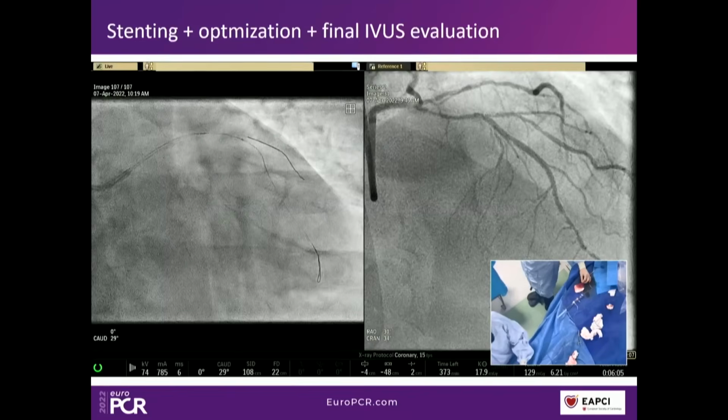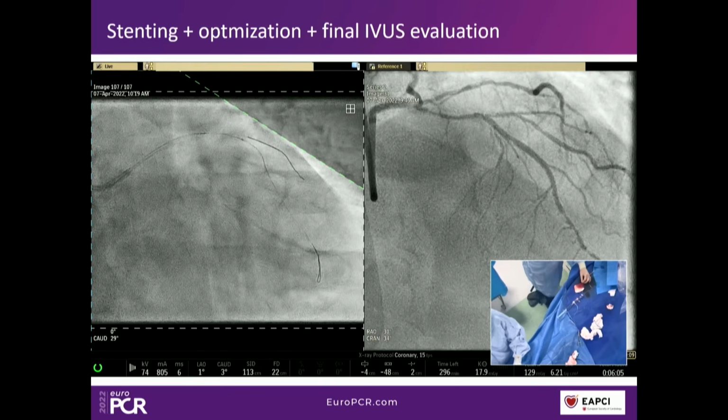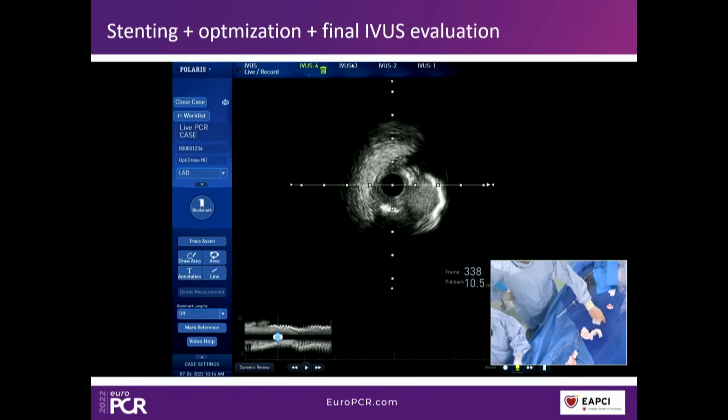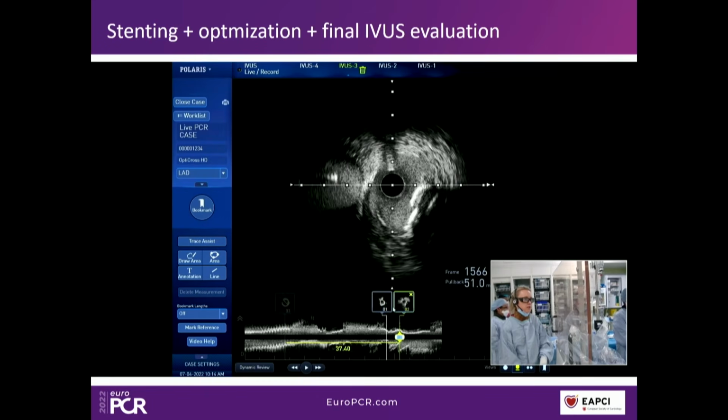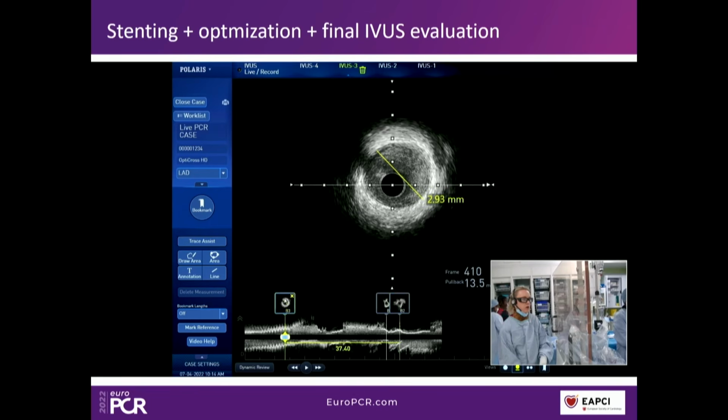Yes, and what about stent sizing, Claudia? What did you think about stent sizing and stent selection? The length from there to the ostium of the LAD is 38 millimetres, with a distal reference diameter of nearly 3 millimetres. So that's just back to the ostium of the LAD. We're going to need to extend further back into the left main.